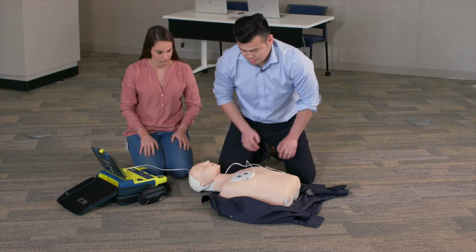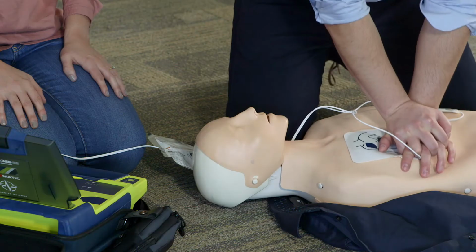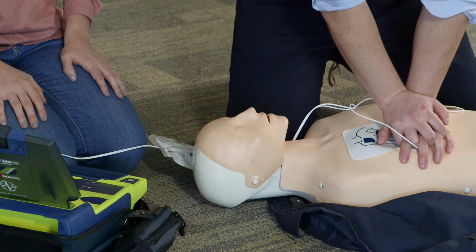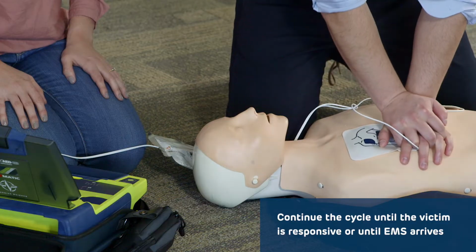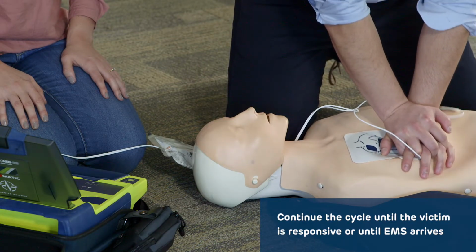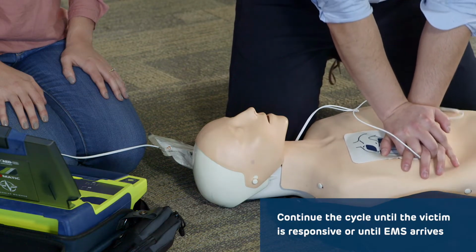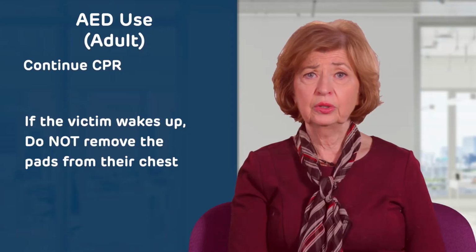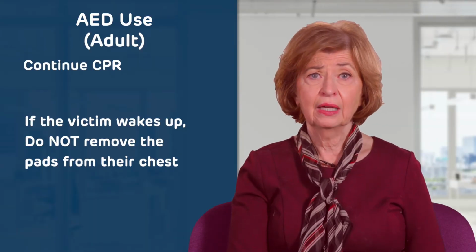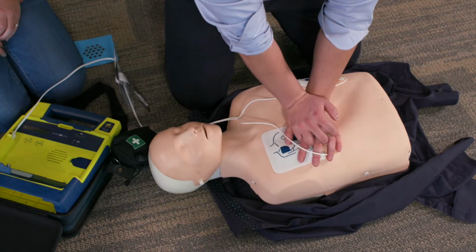Continue CPR. After the shock is delivered, resume CPR until the unit analyzes again. If a shock is not advised, continue compressions. Continue this cycle until the victim is responsive or until EMS arrives. If the victim wakes up, do not remove the pads from their chest. It is not uncommon for another arrest to occur with the need for another shock.